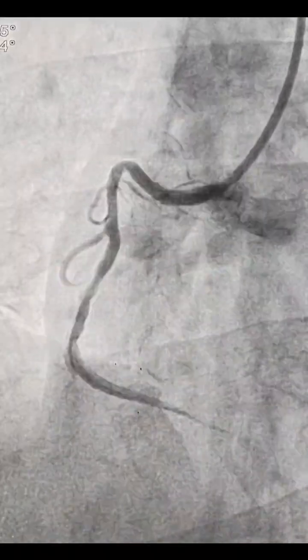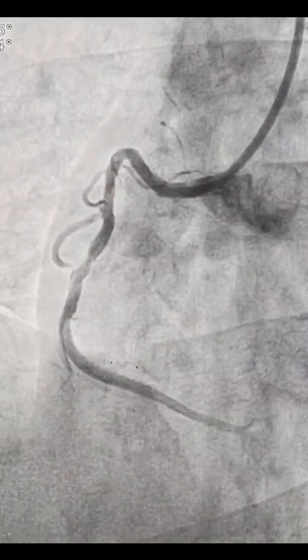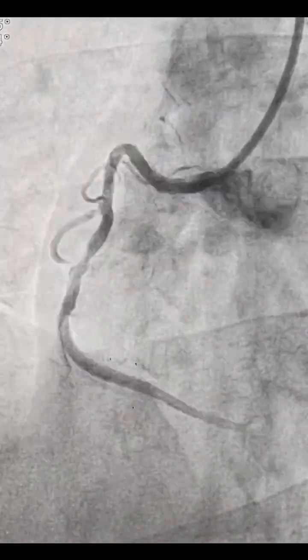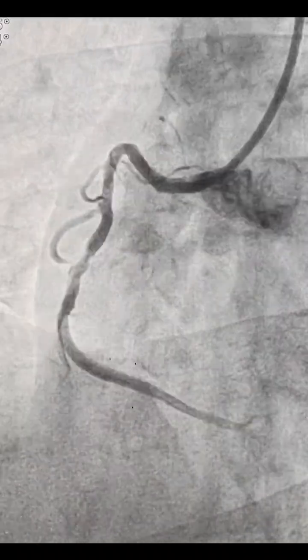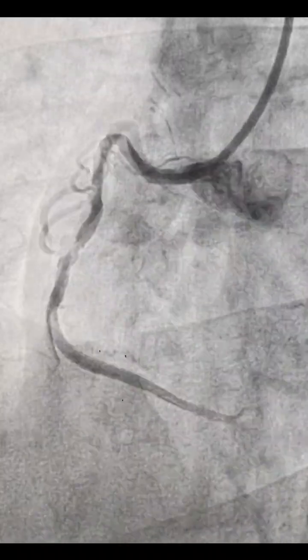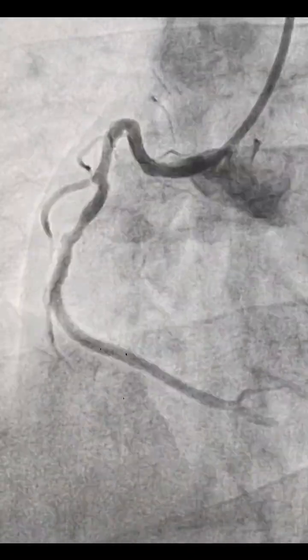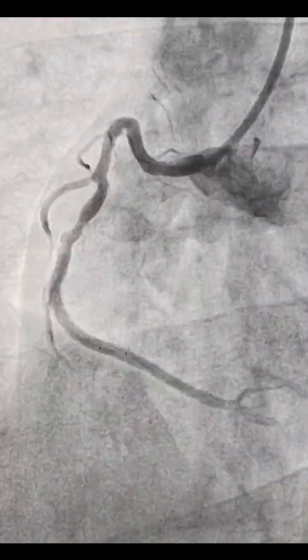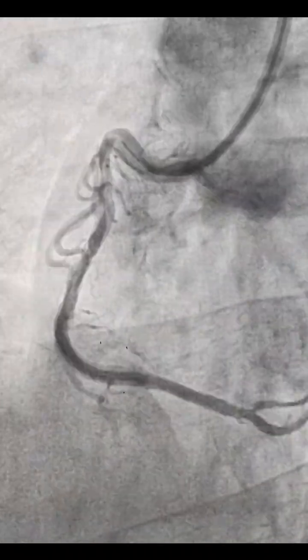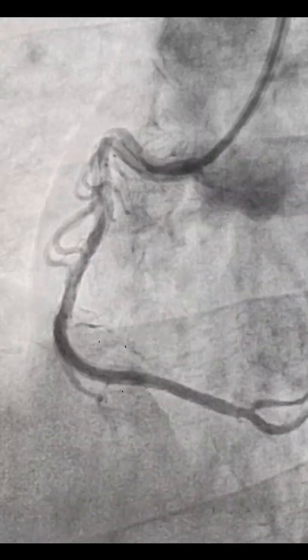This was the angioplasty to RCA and LCX in this evolved inferior wall ST elevation MI, and you can see there was a difficulty in crossing the stent in this Shepherd-Crook RCA, but somehow, gently, I managed to cross the stent. Support and wire support and everything we need to see. So thank you.